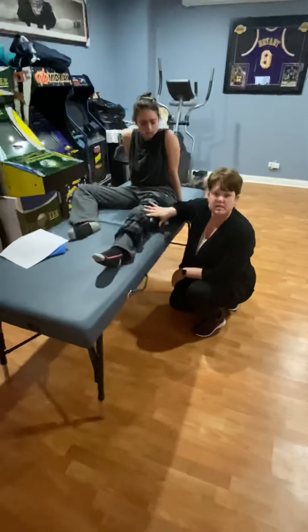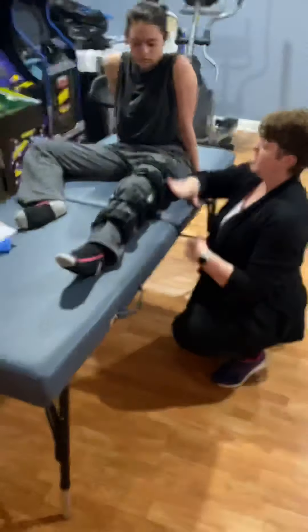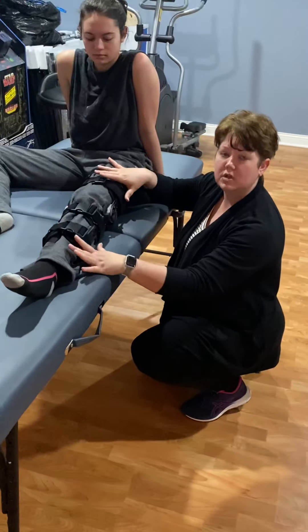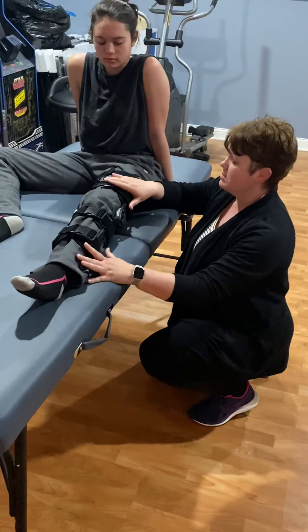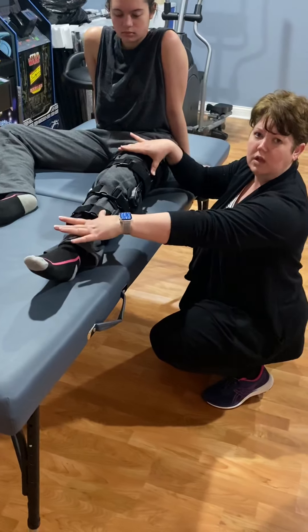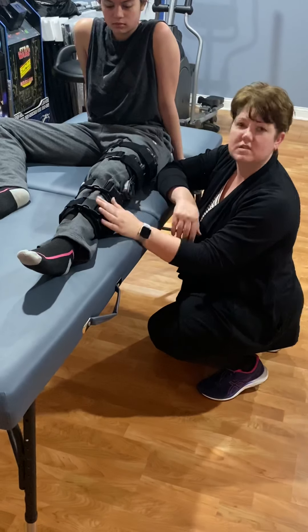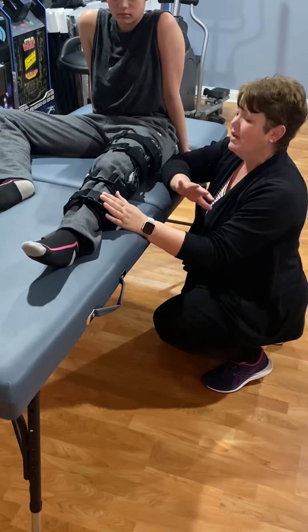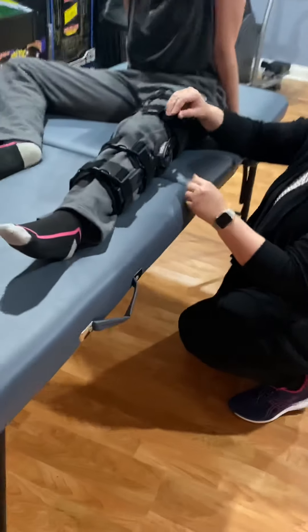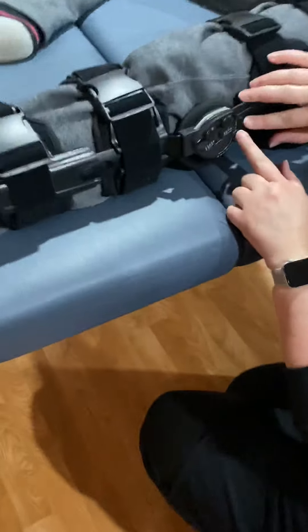We're going to start with the ACL. My patient is in the acute phase, so they have their hinged knee brace on. Sometimes if you see the patient in the hospital, they might have a knee immobilizer on and then you are the one that puts this on for the very first time. Lots of different brands, lots of different ways that these work — so come closer, let me show you.